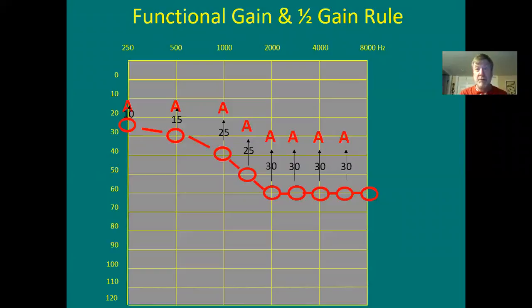I did too, okay? This was in the days just before real ear. They called it functional gain. They took a guy and tested his hearing under headphones. They came up with the thresholds. You can see them here. Then they took off the headphones. They plugged an ear, because you never fit a guy with two ears. Ear, nose, and throat doctors hated that too.